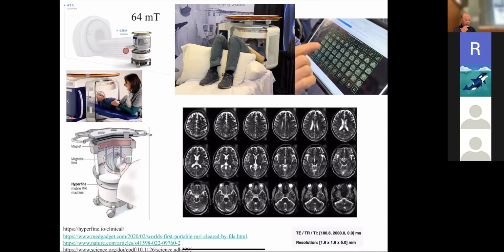For example, I believe the Gates Foundation has bought 20 of these, and they're doing a pilot study in Africa right now, seeing the application of these low field magnets. If you're thinking about projects, this is also a really interesting emerging area to get into. What are the trade-offs they make for doing these ultra low field magnets?